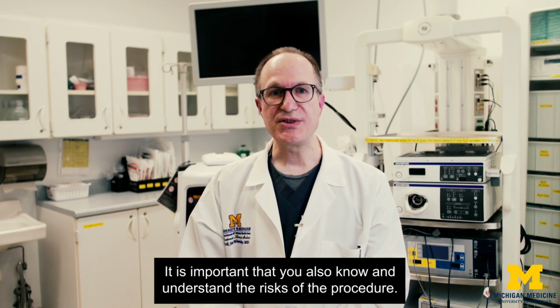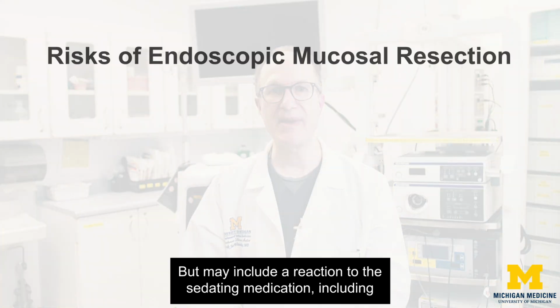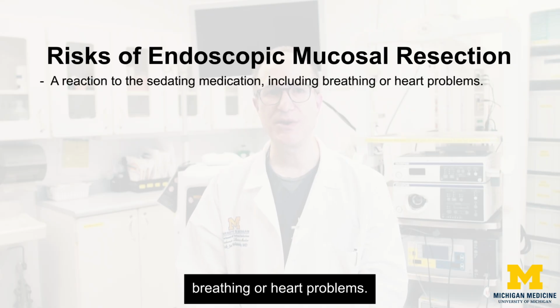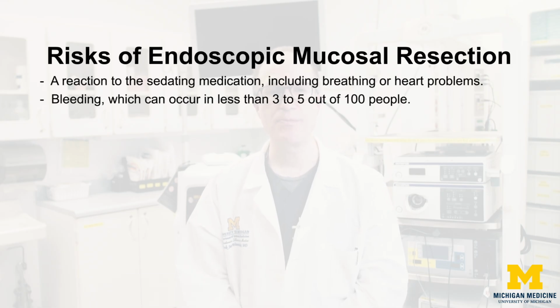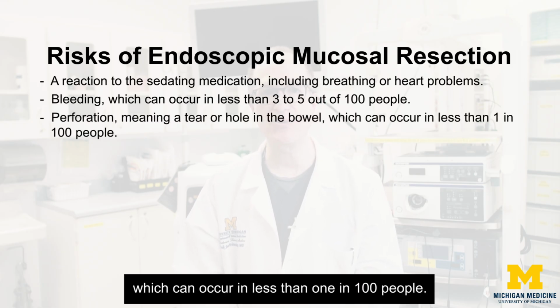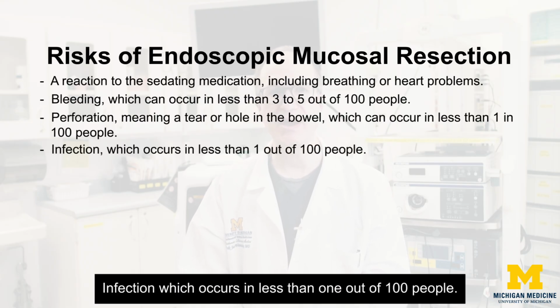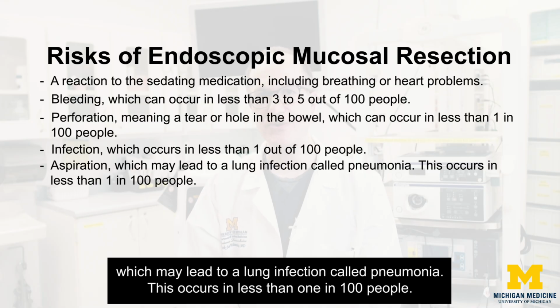It is important that you also know and understand the risks of the procedure. Endoscopic mucosal resection is considered a safe procedure. The risks are low, but may include a reaction to the sedating medication, including breathing or heart problems; bleeding, which can occur in less than 3 to 5 out of 100 people; perforation, meaning a tear or hole in the bowel, which can occur in less than 1 in 100 people; infection, which occurs in less than 1 out of 100 people; aspiration, where the contents of the stomach get into the lungs, which may lead to a lung infection called pneumonia. This occurs in less than 1 in 100 people.